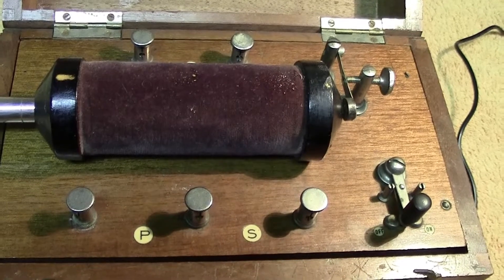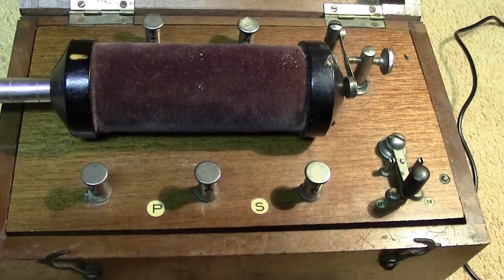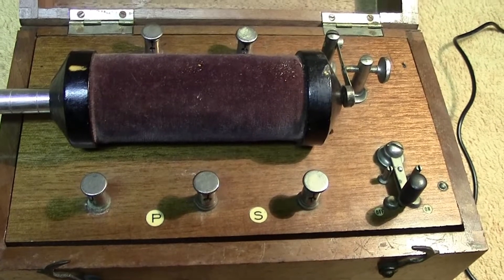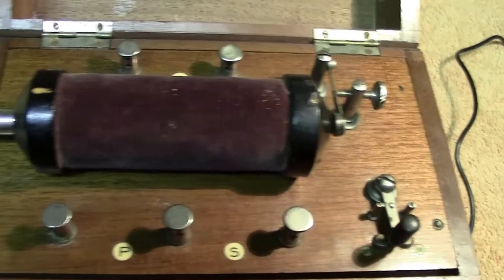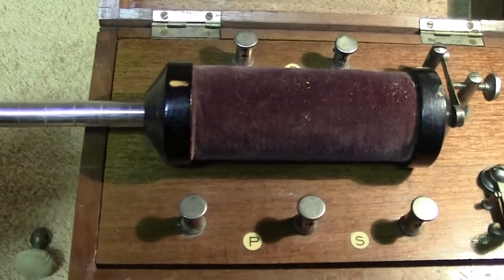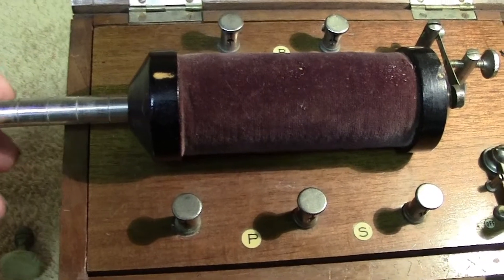There aren't any capacitors in this one. With a proper Ruhmkorff coil you have a paper-and-metal capacitor. The idea of this simply shields the core.